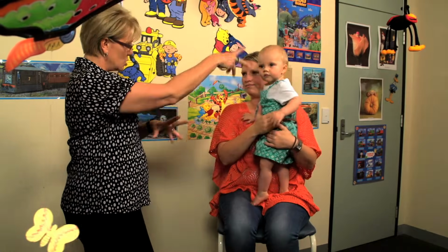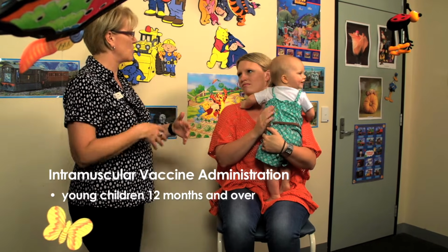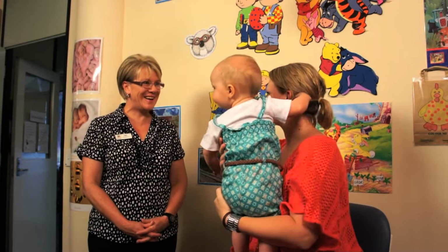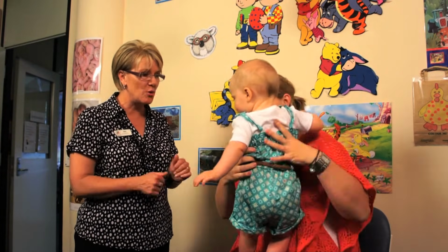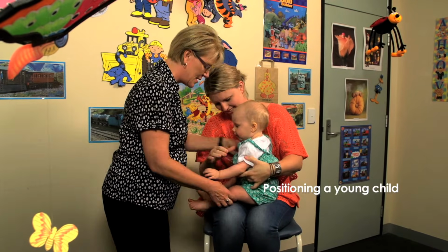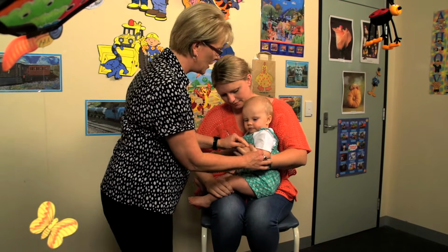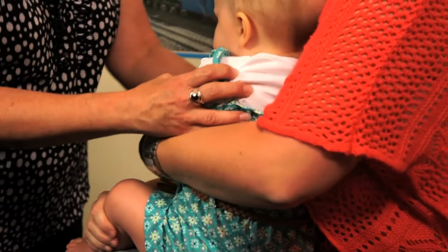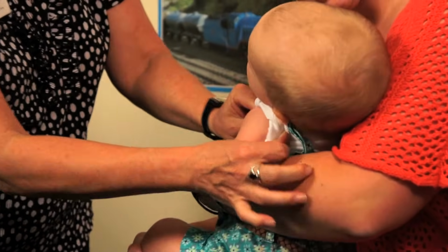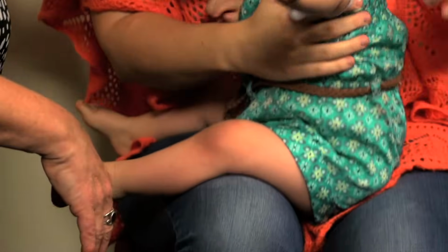This child is 12 months of age and she will be receiving 2 intramuscular injections, 1 in each deltoid. This is the preferred injection site for this age group as it reduces the risk of limiting the child's mobility. By positioning the child sideways on the carer's lap, ask the carer to tuck the child's non-injecting arm under the carer's arm and behind the back of the carer. The carer then holds the arm to be injected securely by the elbow, close to the child's body. Securing the child's legs will help to stabilise the child.